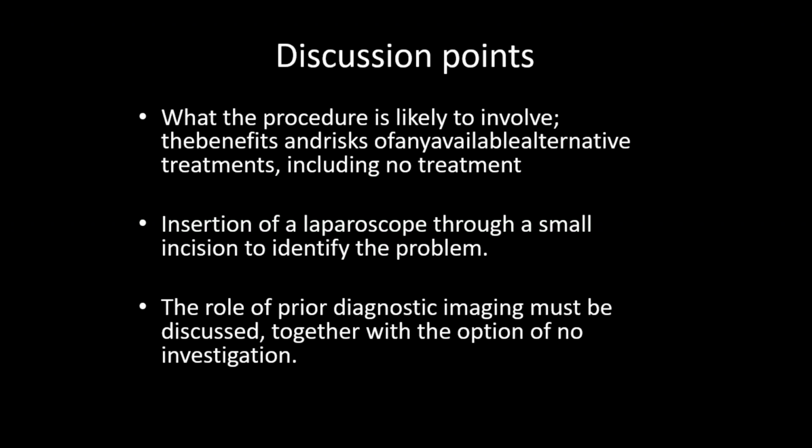I hope no one went through this experience, but it's a very natural reflex: when you think you have an injury with insertion of the trocar, you withdraw it. This is a major mistake. You should leave the trocar in situ. Don't move, because the withdrawal may extend the primary injury as well as lead to another injury.